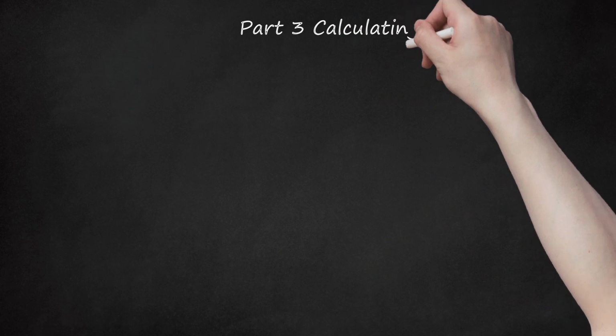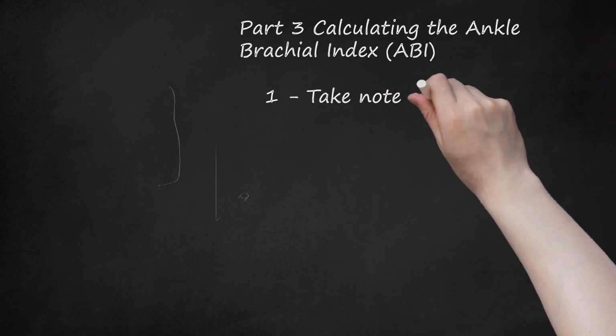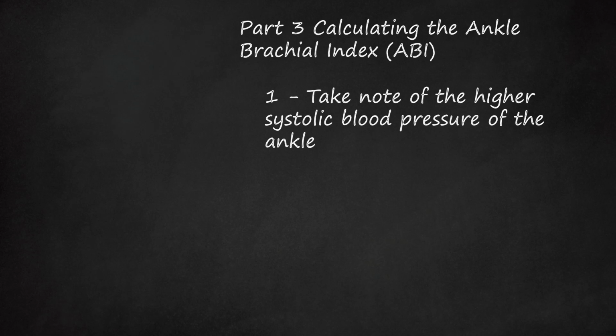Part 3. Calculating the ankle brachial index, ABI. 1. Take note of the higher systolic blood pressure of the ankle. Compare the left and right ankle readings, as well as the DP and PT artery readings of both ankles. Whichever number is the highest from each ankle will be used to calculate the ABI.